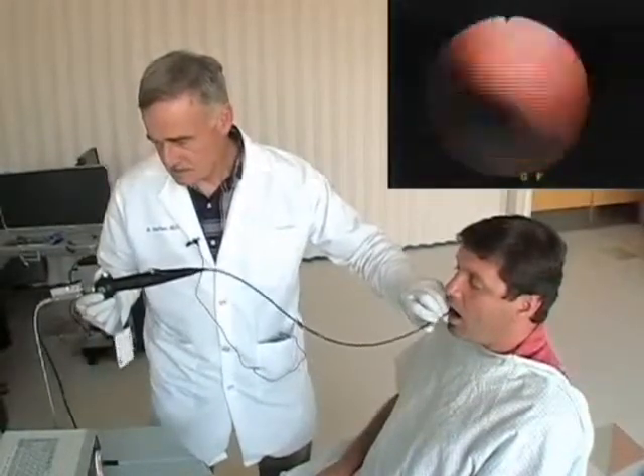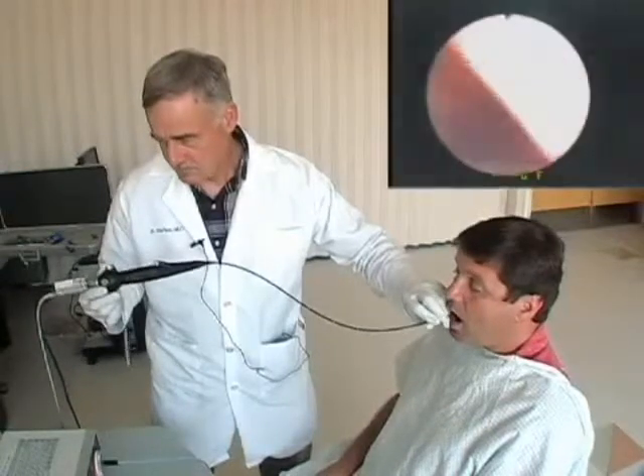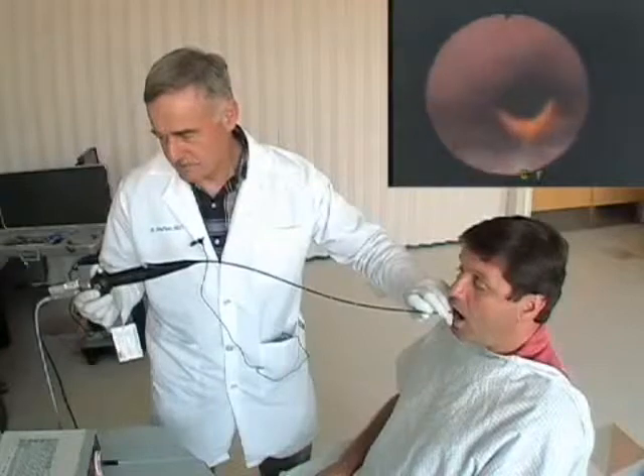Say E. Beautiful shot of the vocal cords. Just breathe in and out deeply.